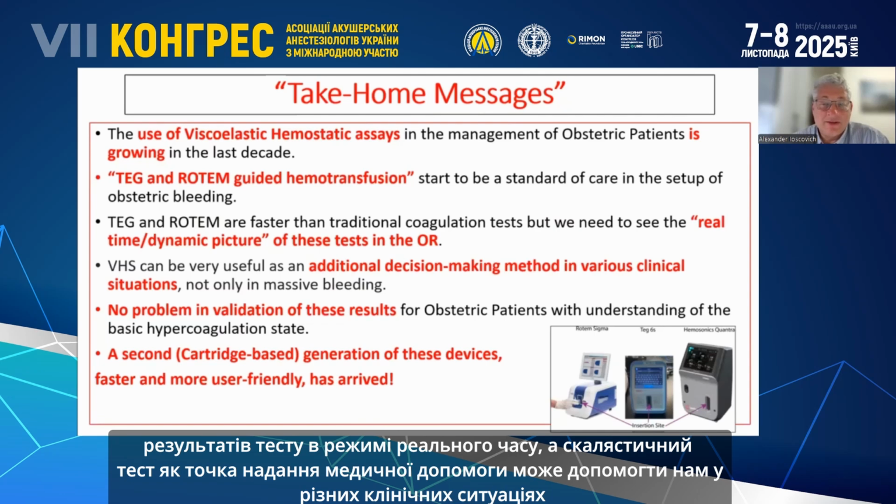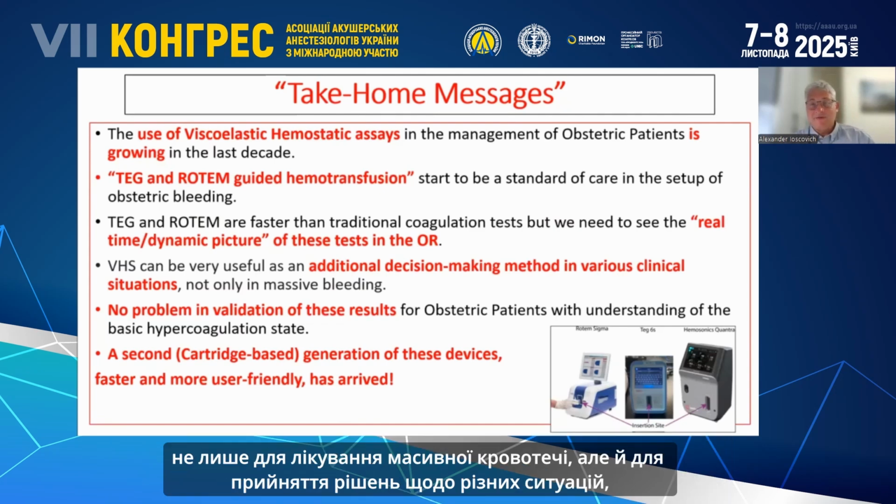Viscoelastic tests as point of care can help us in different clinical situations, not just for treatment of massive bleeding, but for making decisions about different situations.